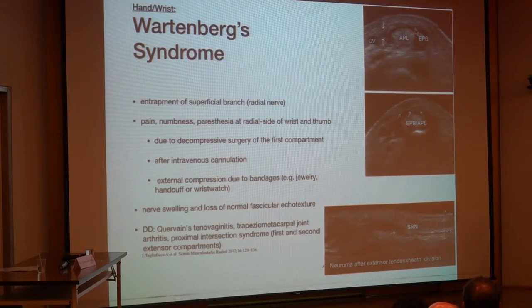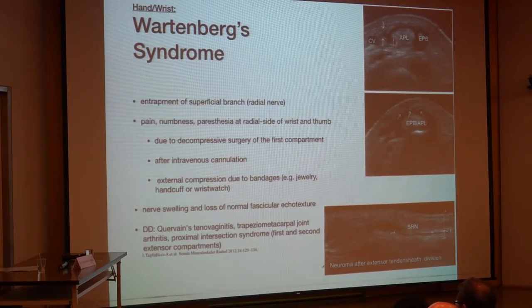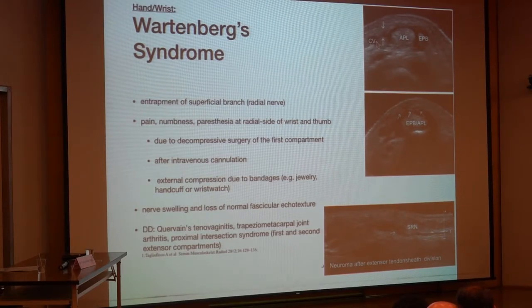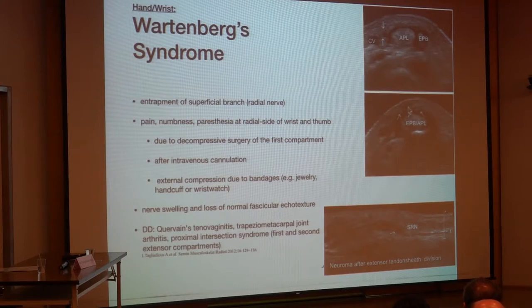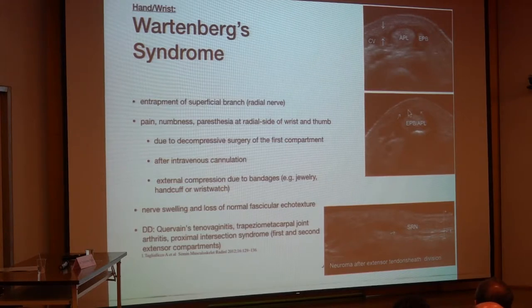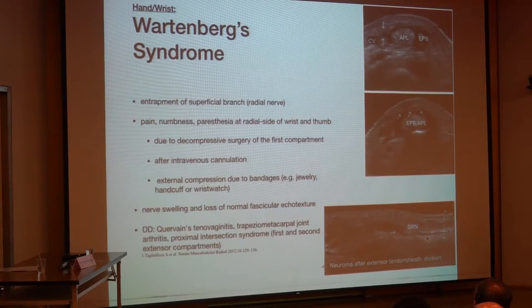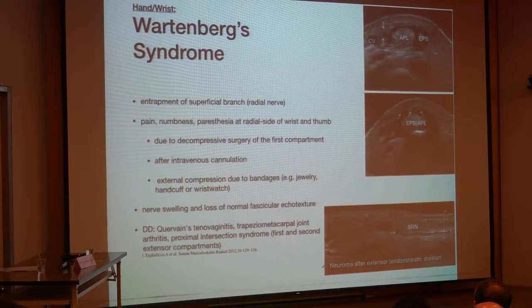Here is the typical location and presentation. This is the first extensor compartment, housing the abductor pollicis longus tendon and the extensor pollicis brevis tendon, covered by the retinaculum. Close by is this small nerve, the superficial radial nerve, which goes with the cephalic vein. We can see the nerve going over the first extensor compartment, with scar tissue after surgery of this compartment. In the longitudinal scan, we can see this tiny nerve increasing to a neuroma after surgery.